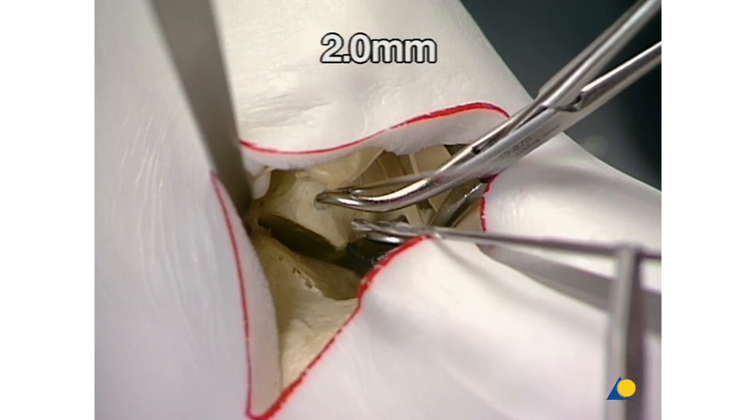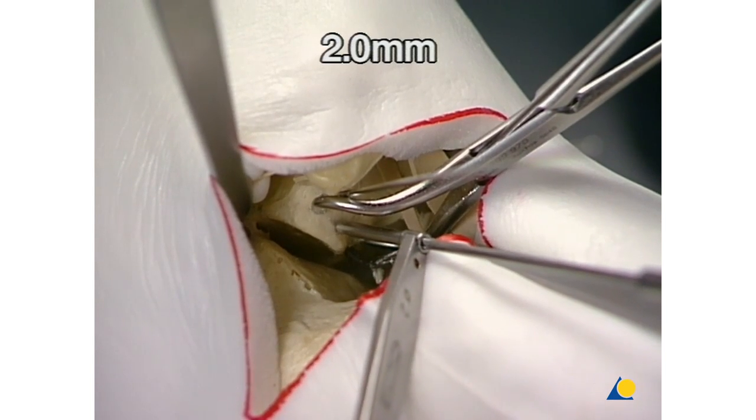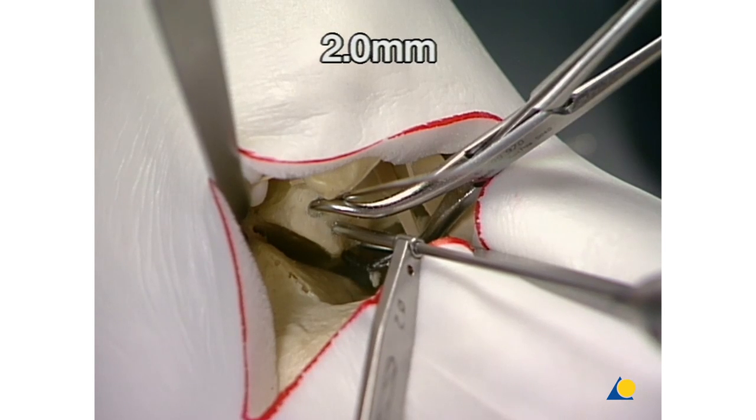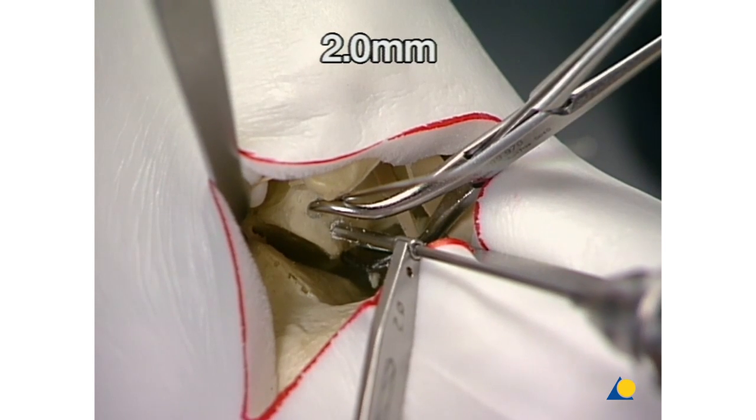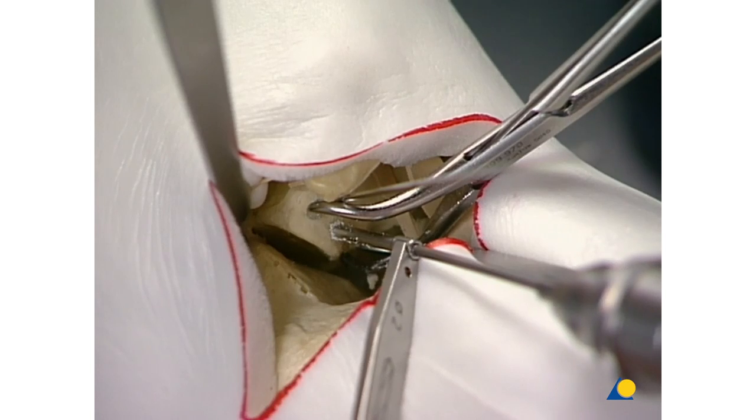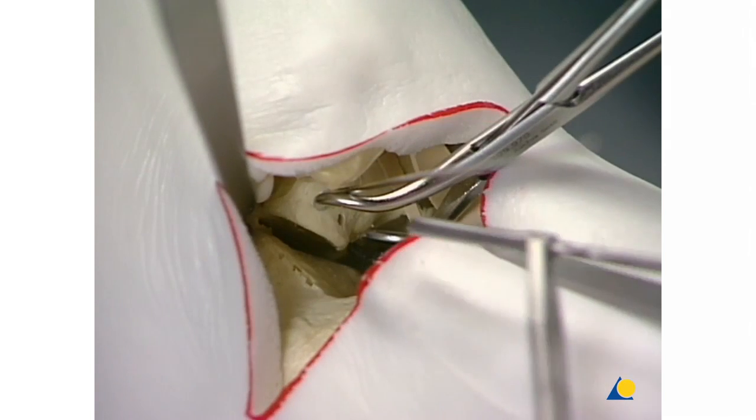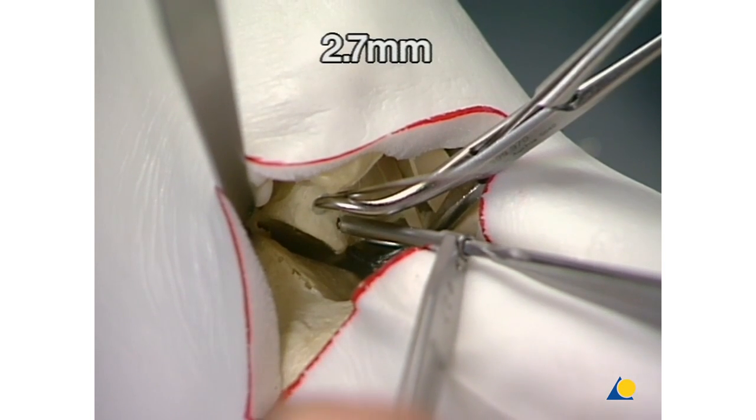We first choose a 2mm drill bit for a 2.7mm lag screw fixation in the sagittal plane. Over-drilling with the 2.7mm drill bit.